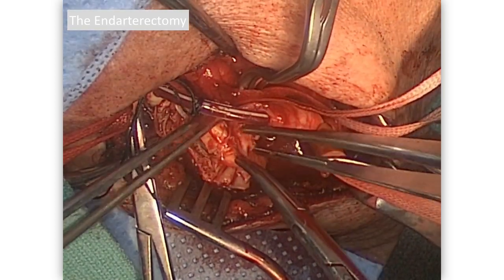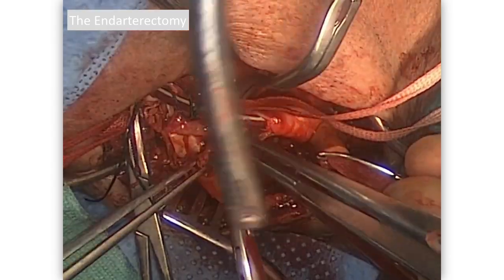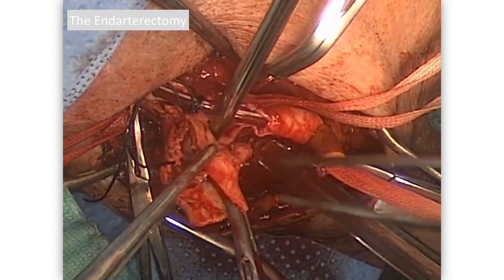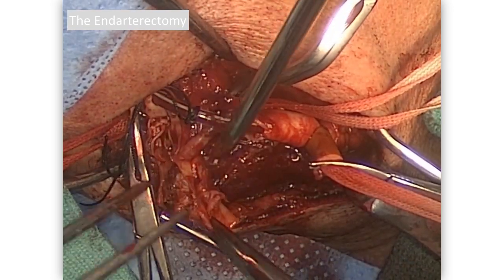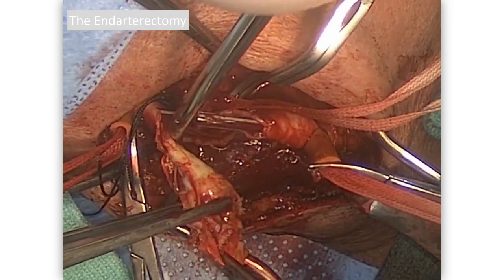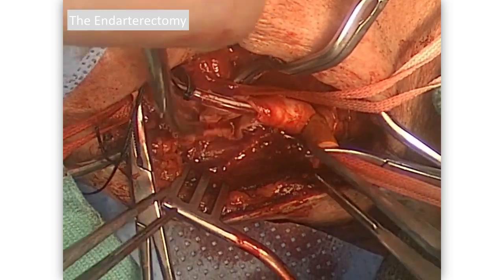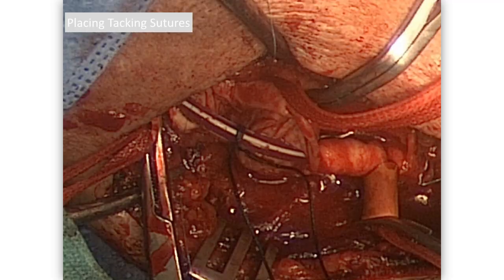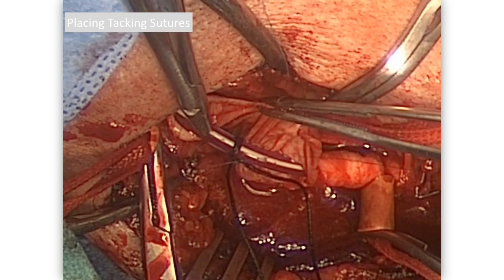Pull the plaque out of the external carotid — in this case there's a fairly sizeable chunk that comes out. You can back bleed vigorously if you want. All traction on that atheroma should be inferiorly, towards the feet — pull it inferiorly and separate it. You want to see it separated off nicely. There's a little strand which we grab and take off. Typically we'll switch over to Gerald's forceps at this point to clean it up.